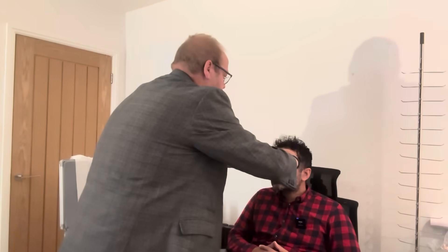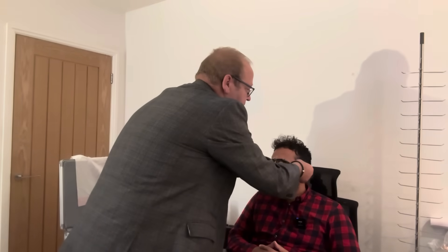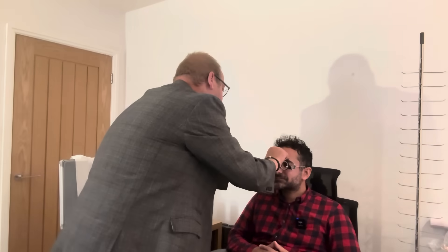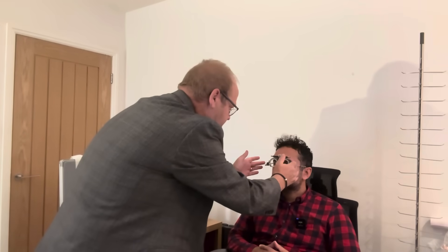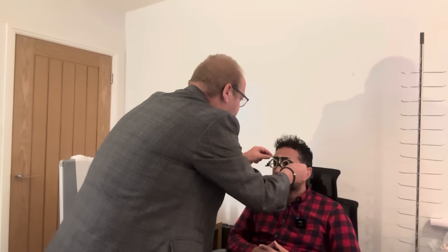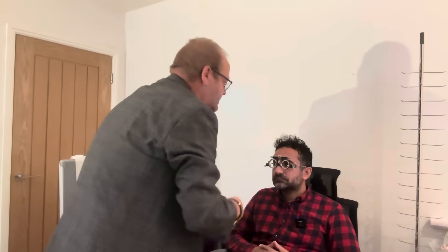I've got this trial frame. I'm just going to put this on here. It'd be better if I get it behind your ears. Yes, that looks alright to me.